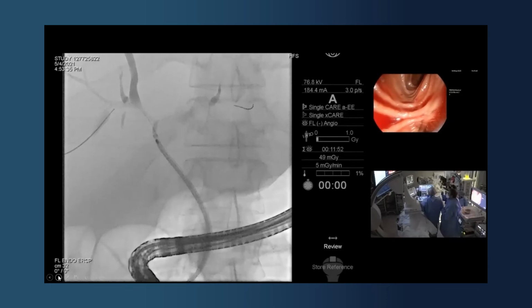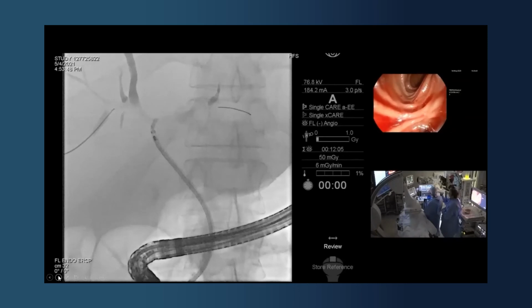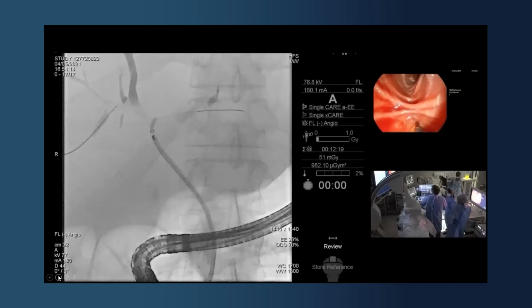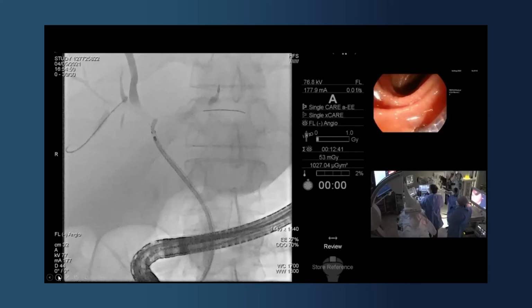Now this will be the difficult bit. Do not let your wire come back. It's going to be difficult, this. It's such a difficult bend. This can be absolutely critical, and this is where sometimes we need a super stiff wire, actually. That's interesting, even despite pre-dilatation, it will not get round that bend. So the problem here is that the 025 wire is too floppy.